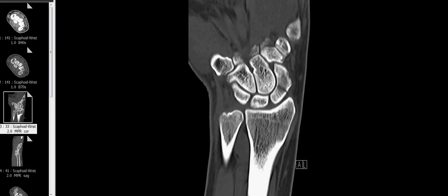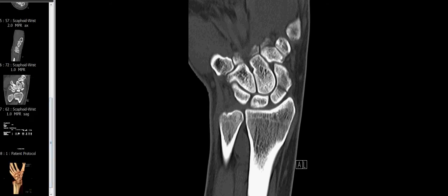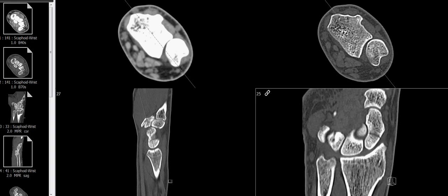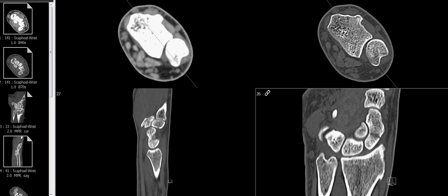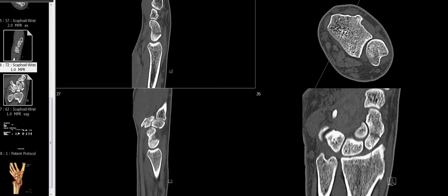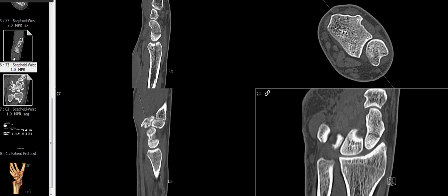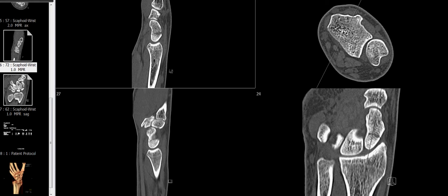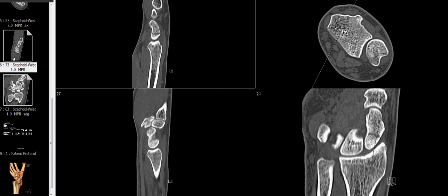It's a little bit of an oblique angle because the sagittal plane for the wrist cuts through the fracture and through the scaphoid obliquely. So we've been working on doing dedicated scaphoid views. What the technologist did was take a coronal oblique image and then create an imaging plane along the long axis of the scaphoid — because it has a long and a short axis. This produces the sagittal oblique scaphoid view — the long axis sagittal oblique scaphoid view.